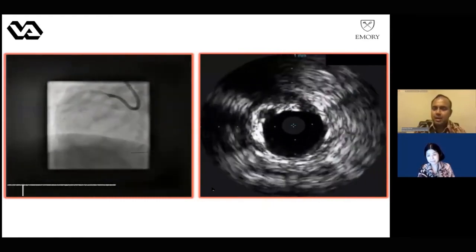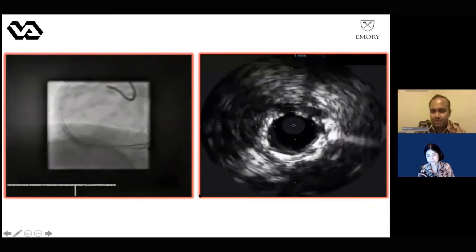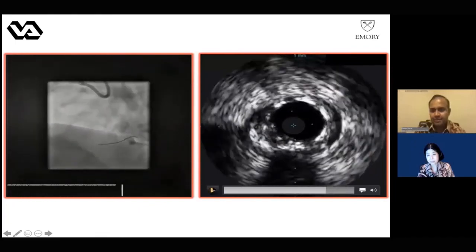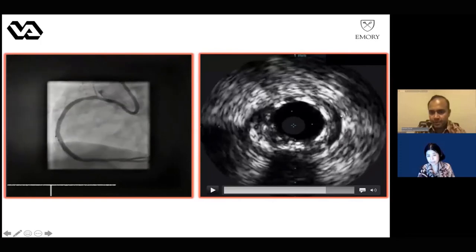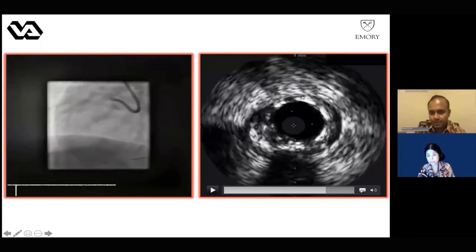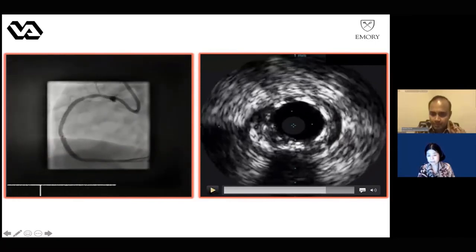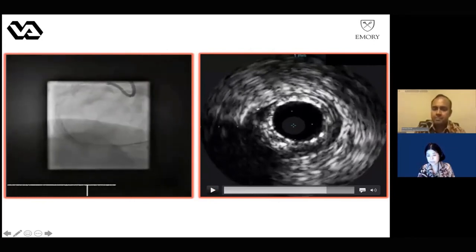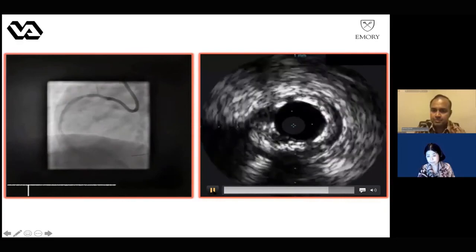Yeah. And as we get more proximal, now this is the proximal edge of the stent, and I will pause it for you here, Akiko, so you can tell us what you're seeing there. Yep. So starting here, there is a very funny finding. Currently at 3 o'clock, there is a dark area, which is outside of the intima, right? And also a little bit at 10 o'clock. Yeah, you see the dark area. And most likely that is contrast staining, or could be blood. And then go more. And here it is even more clear.